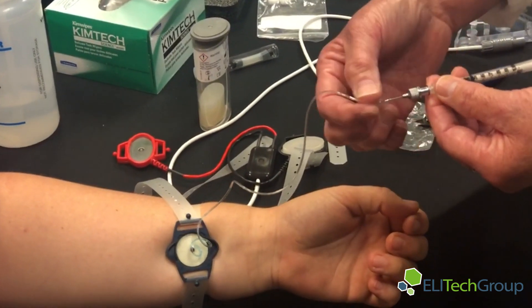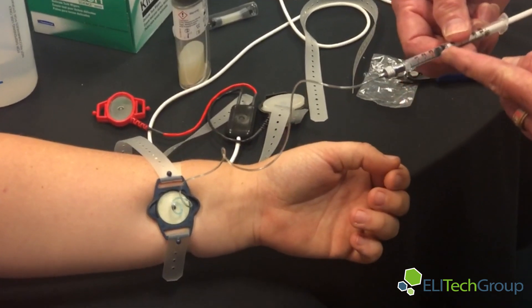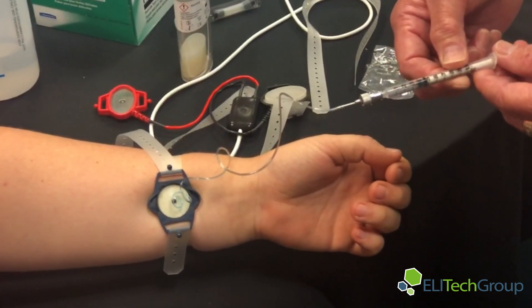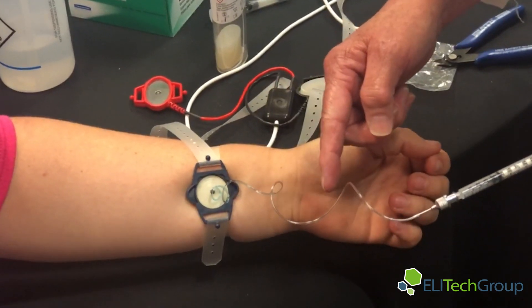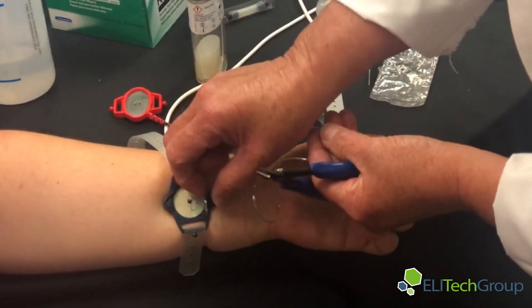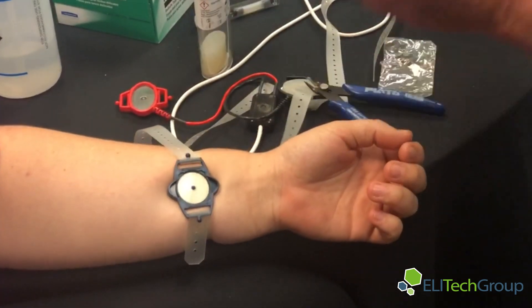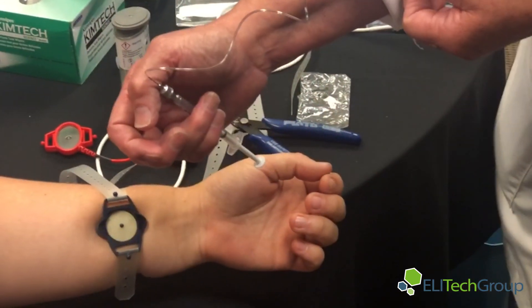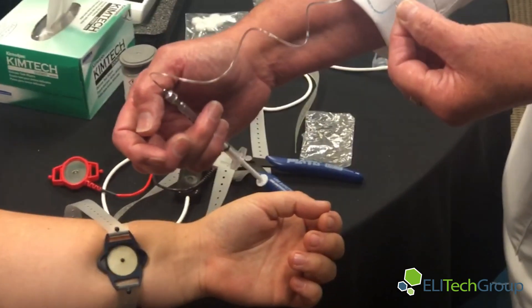You can see the needle is tapered and fits really easily into the micro-bore tubing. I already pulled up on the syringe so we have a little bit of air. You just want to barely move it to cause a slight vacuum to get the sweat collected and back into the tubing — just barely pull it back. You can see that I've caused a vacuum, and a little bit of blue has come back — the blue sweat is now within the tubing itself.